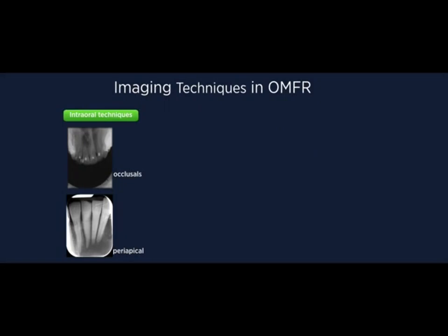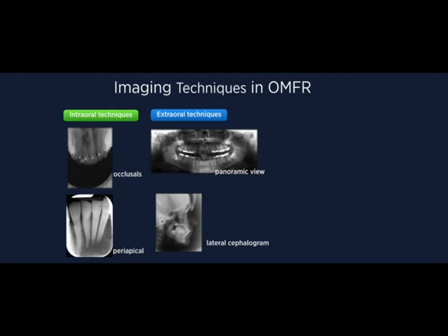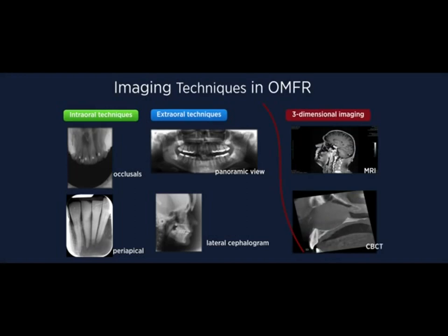First on the left, intraoral techniques like occlusals and the periapical, but also on the right side extraoral imaging modalities such as panoramic view, lateral cephalograms, which are two-dimensional, and on the far right, an MRI and a CBCT, which are both three-dimensional and thus also termed advanced dental radiographic imaging modalities.